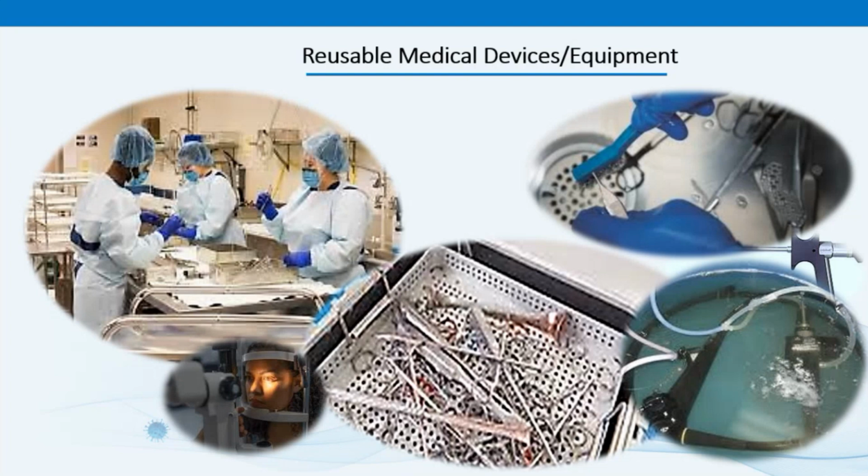These devices are made of materials that can withstand repeated reprocessing and the use of chemicals. Some examples are surgical instruments, such as clamps and forceps, scopes like endoscopes, bronchoscopes, duodenoscopes, and colonoscopes, and dental equipment like mirrors, amalgam condensers, and impression trays. Now, reuse of medical devices is a necessity. Reuse controls costs because facilities don't need an inventory of extra devices, but it also adds pressure to reprocess quickly.